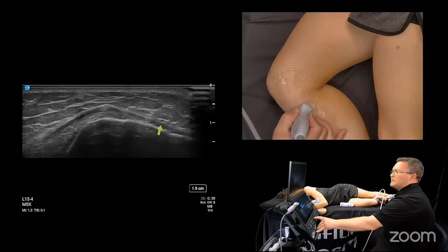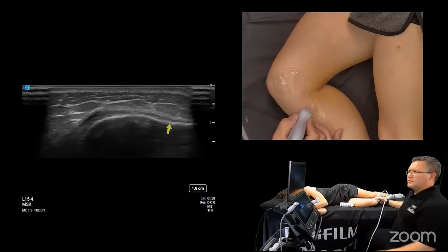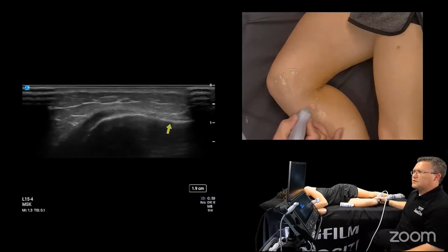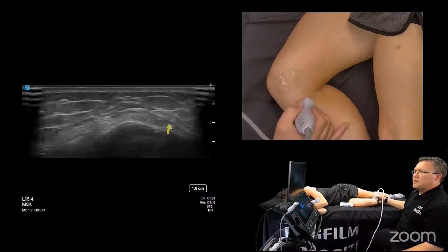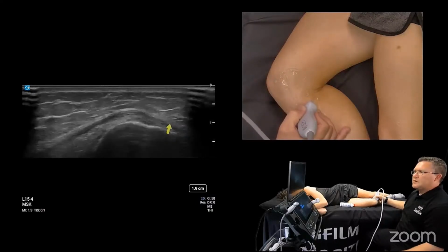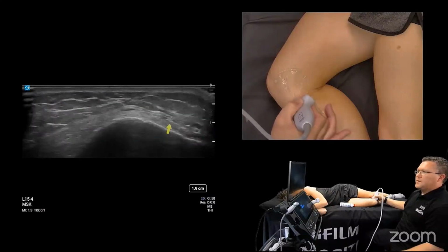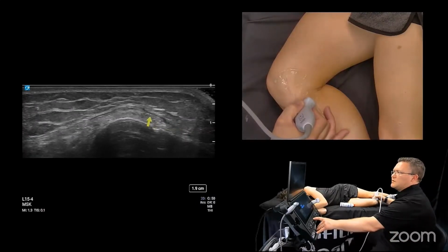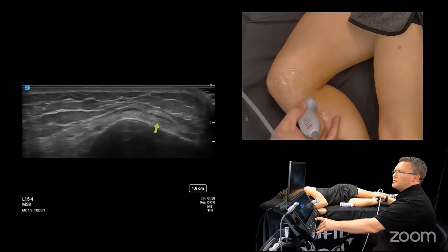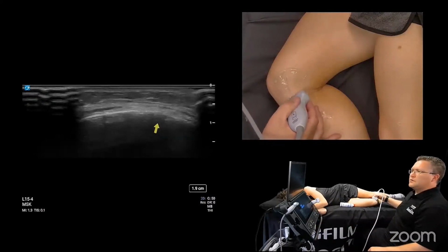But here it is, still anterior tibia almost. There I can see the last little segments of its insertion right there. So I do need to constantly remember just how broad of a structure that is. I'm just scanning from proximal to distal, up and down. And then just like we saw on the PowerPoint slide, here's the cross-sectional MCL right here. And I could show that with a bit of anisotropic artifact, I'm sure, closer up to the joint line.